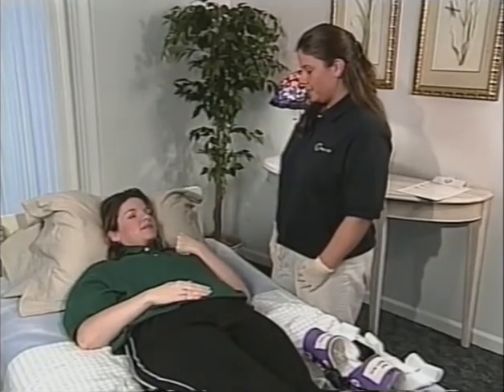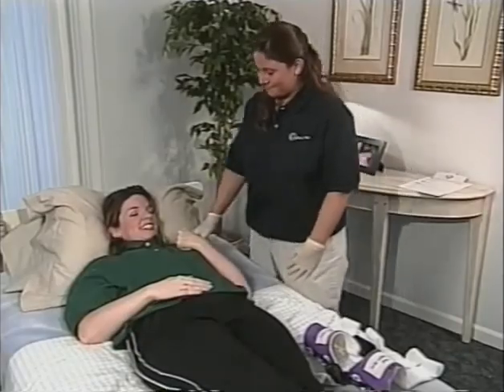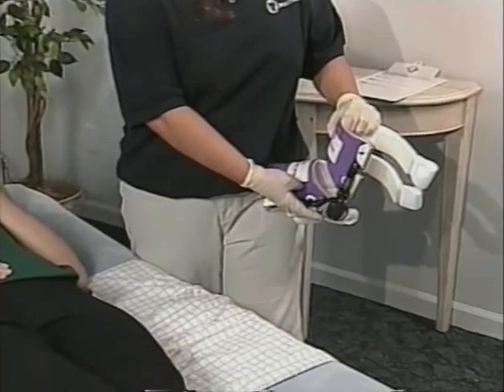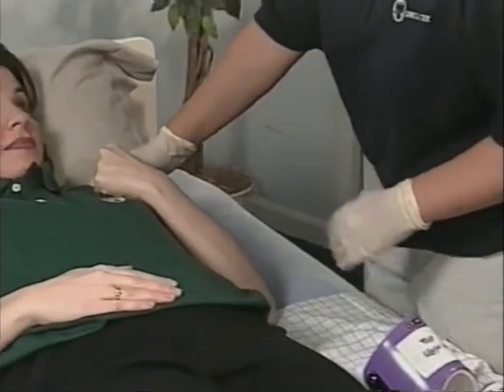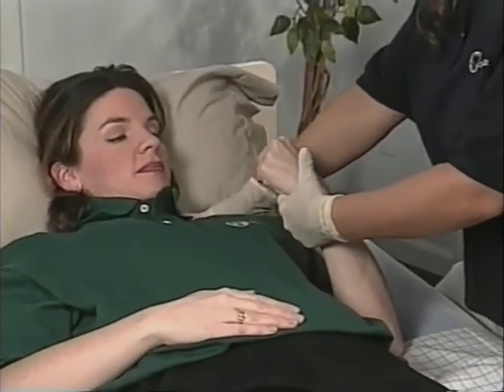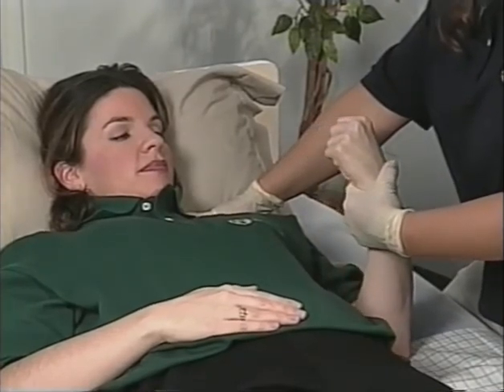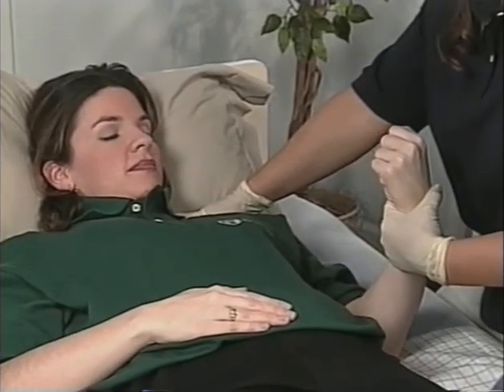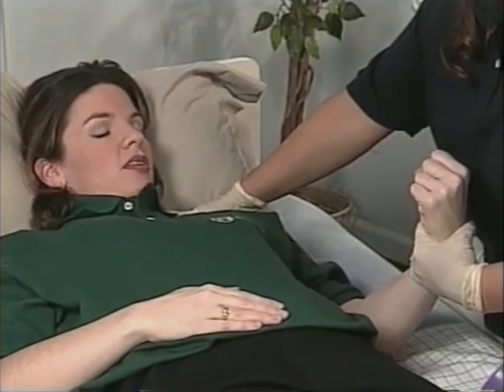Here's a demonstration on how to apply an elbow Ultraflex orthotic. First, talk to the client. Feel good? Yep. Prior to putting orthotics on, make sure the Ultraflex is in a locked position. It's important to do a short course of range of motion to the affected joints. Support the shoulder joint both posteriorly and anteriorly, or front and back. This is important to prevent dislocation. Use a firm, steady, but gentle pressure, and pay attention to the client's facial expressions for noted grimacing.